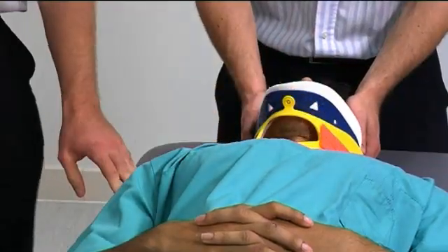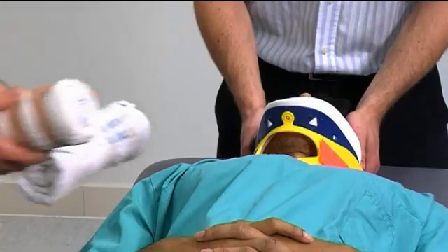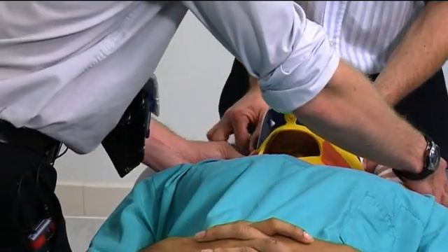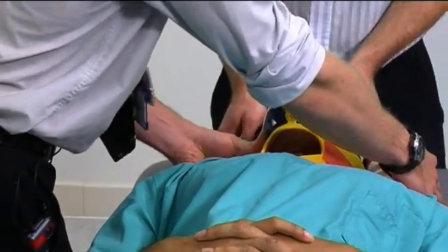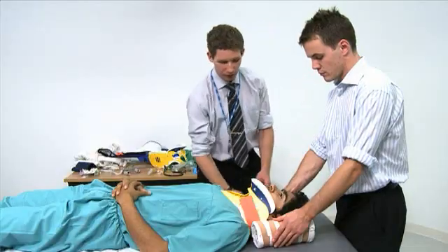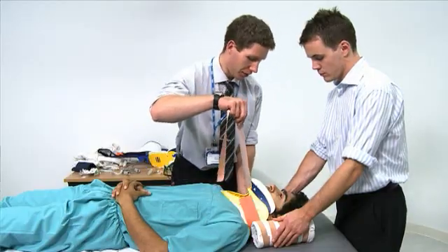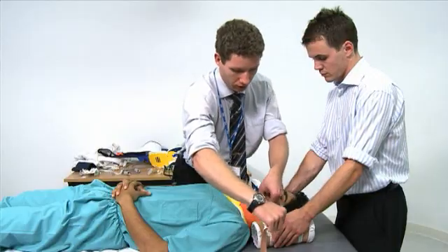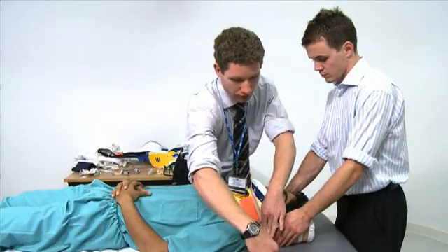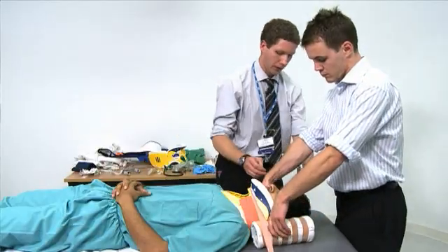You then want to use sandbags and tape to effectively secure the C-spine. Place the sandbags in position and they can then be compressed by your assistant. Then tape the sandbags in position, making sure the tape is attached to the bed frame, the sandbags, the base of the collar, the sandbag, and the bed frame again. Then do the same along the top.